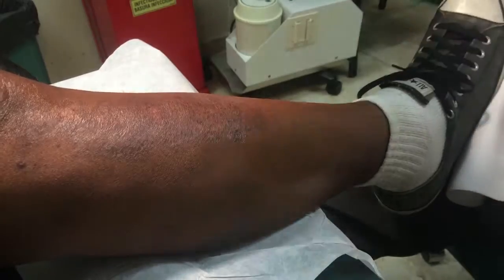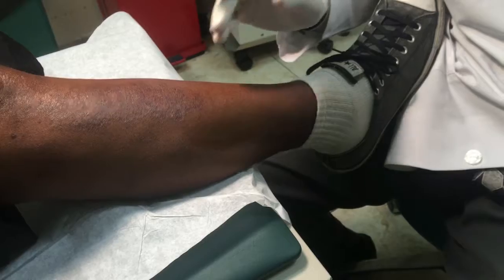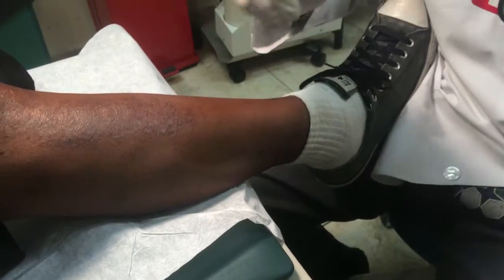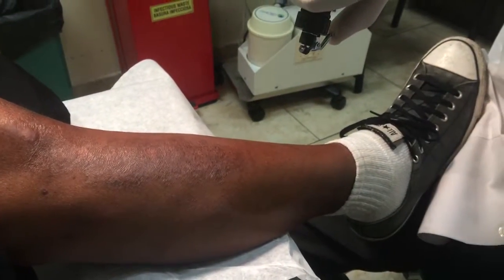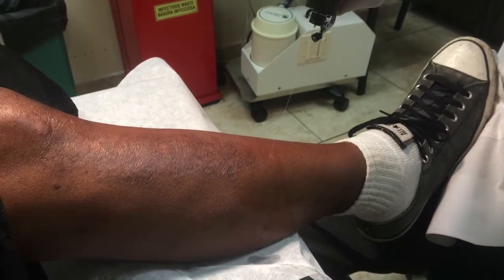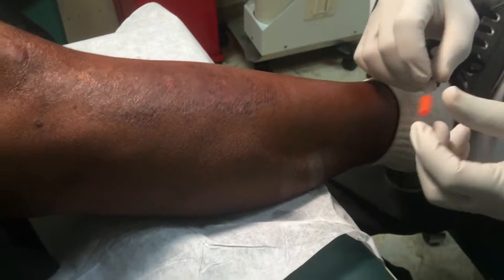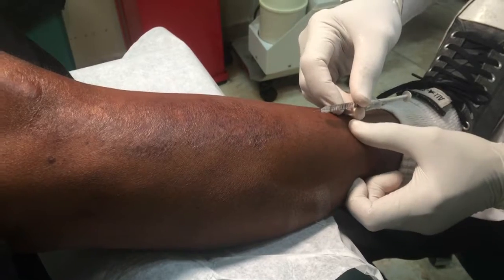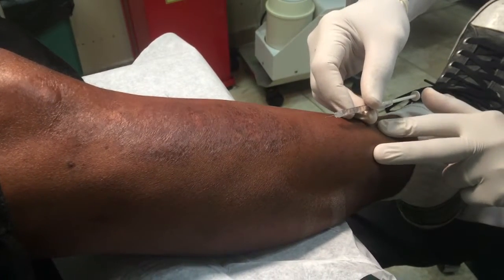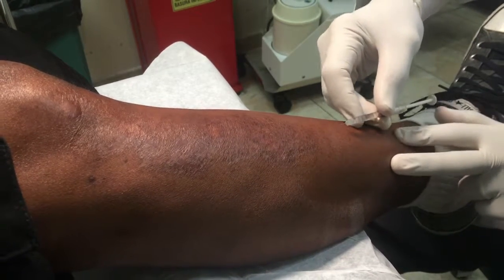Now make sure it is dry before you proceed. I will numb the area with a topical anesthetic — it's the ethyl chloride, just a little bit — that will numb the superficial skin. Then I'm going to use 1% lidocaine with an insulin syringe. The needle is about 30 gauge so it would not hurt the patient much, especially after using the ethyl chloride.